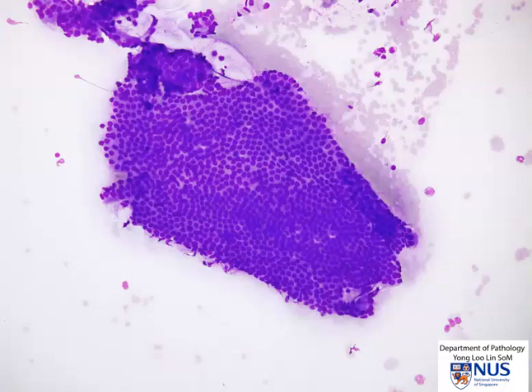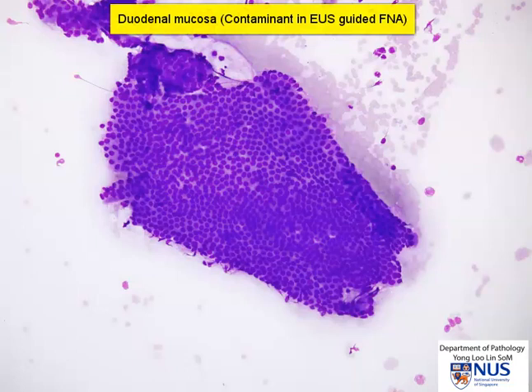Hello, here is an example of normal contaminant duodenal mucosa seen in an EUS-guided FNA, endoscopic ultrasound-guided FNA. Usually when there is a lesion in the head of the pancreas, the needle will traverse the duodenal wall in order to reach its target and sometimes may pick up some duodenal epithelium.